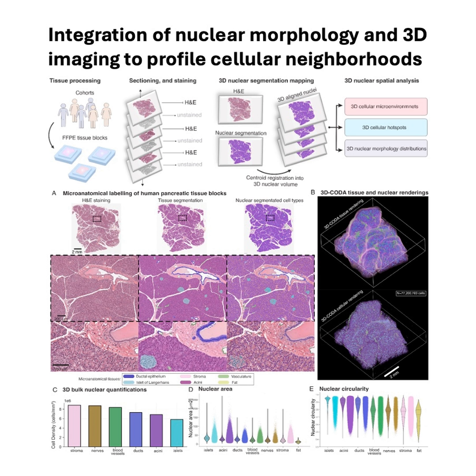This is where it gets really fascinating. The 3D analysis completely changed the picture of immune hotspots. You know, those areas where immune cells congregate. How so? Well, traditional 2D methods, because you're just taking sparse slices, can really distort the spatial density and connectivity. Imagine seeing a few immune cells clustered on one slide. Are they really a dense cluster in 3D or just happening to line up in that one slice? Right, it could be an illusion of the 2D view. Exactly. But the 3D volume revealed much more localized and precise patterns. It showed exactly where these immune cells were truly clustered and presumably interacting.